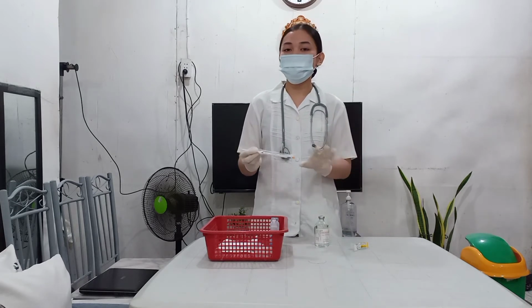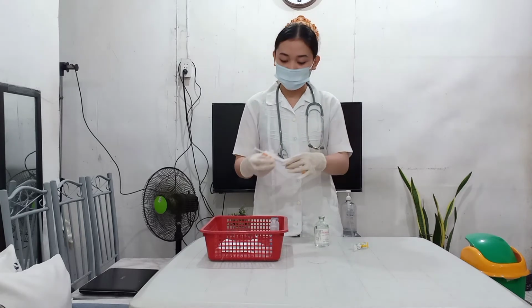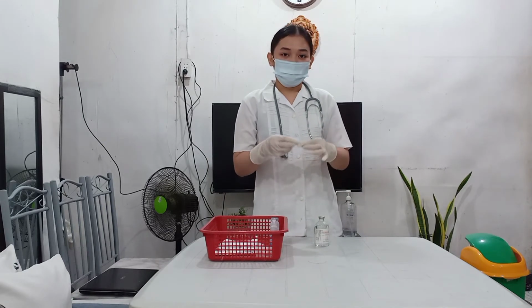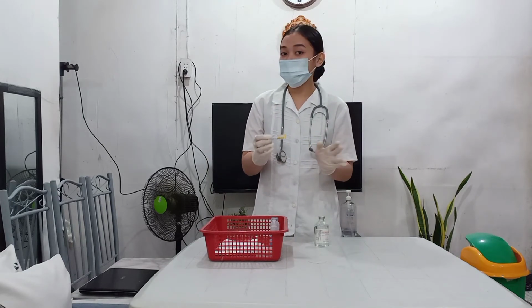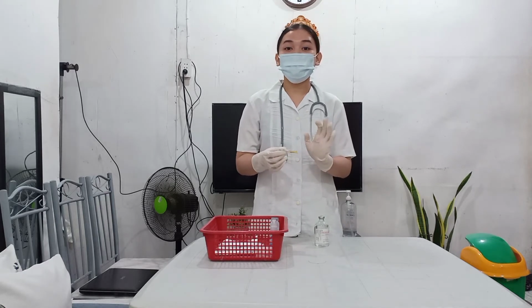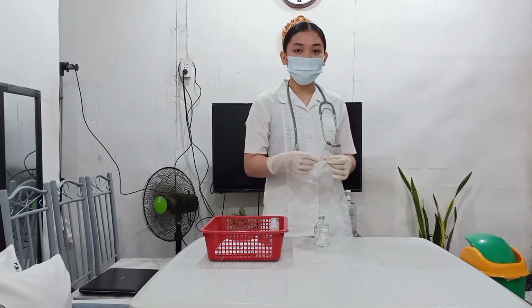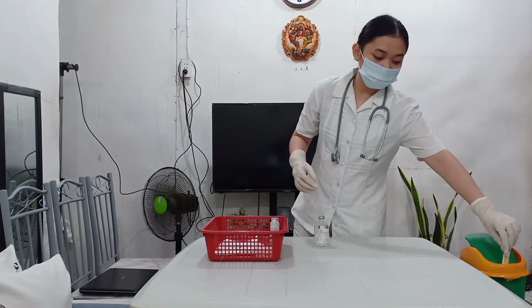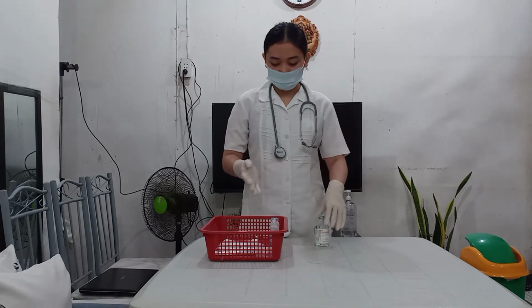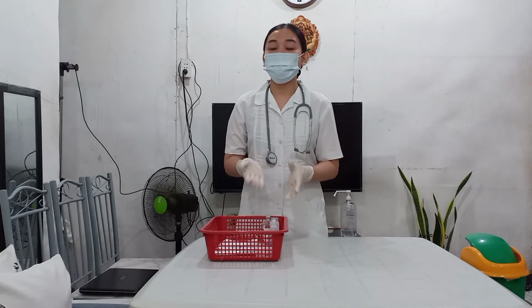So we will not remove this package unless we go to the bedside table of the patient. And then we will dispose this filter needle appropriately in the sharps bin so that no one will be injured, especially the patient or the collector of the garbage. Now, we are done preparing the medication from the vial and the ampule.